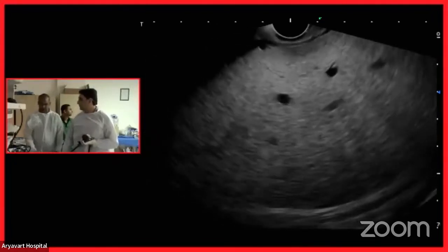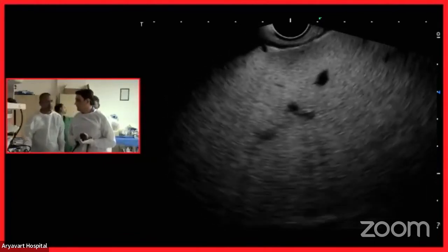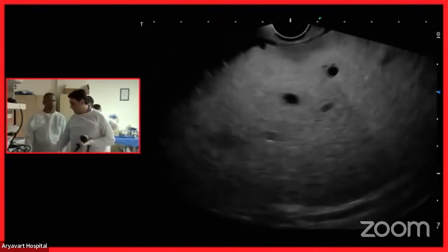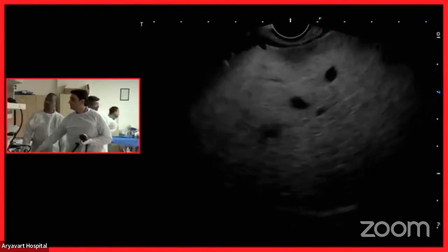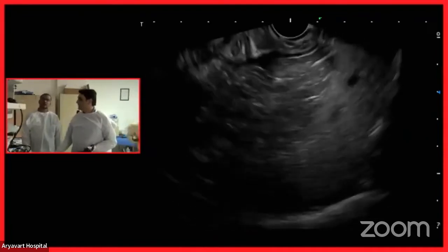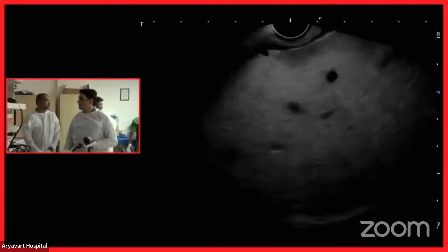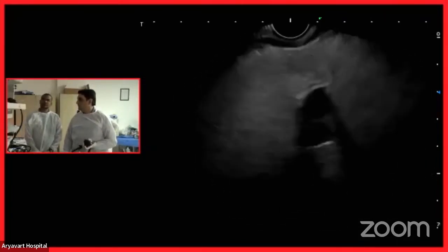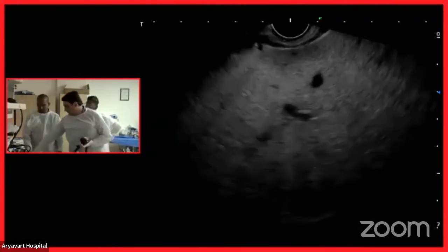Do you have the Fibroscan report of this patient? Maybe change the contrast a little bit. Here LSM is 8 kilopascal. And what is the CAP value? 320 is the CAP value. Okay, so it looks fatty, with F2 fibrosis. We can see the fatty liver, and in between we can see there's a probe.